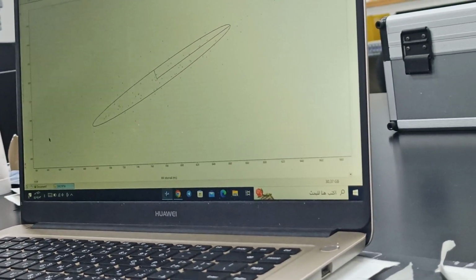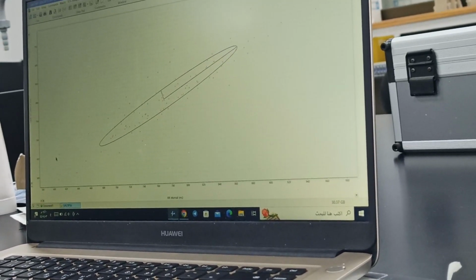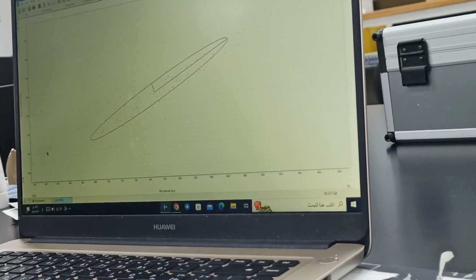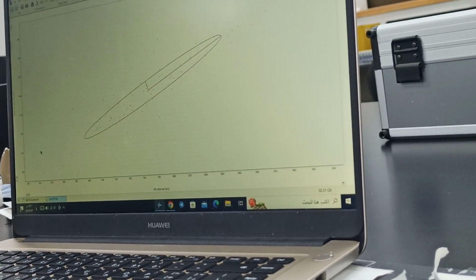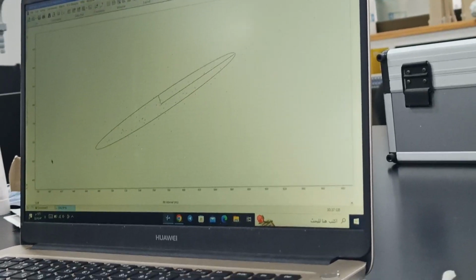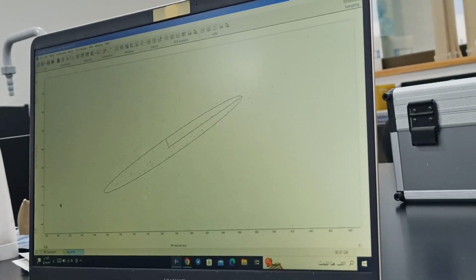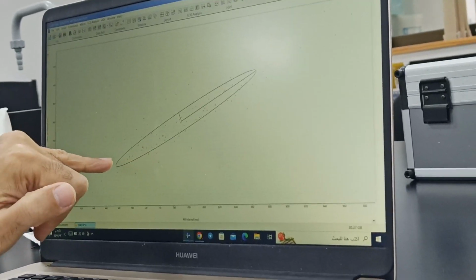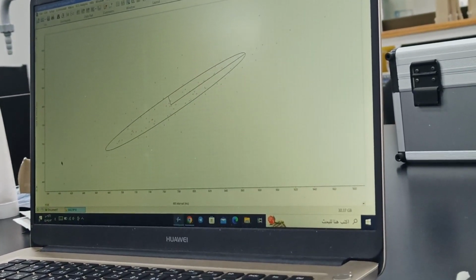This again is telling you the variability immediately on a graph. That is, we have got quite a scattered plot. Good. But scattering up to a certain limit is good. Beyond those limits, again there will be a disease process. So this small one ultimately is calculated as SD1 and the large one as SD2.